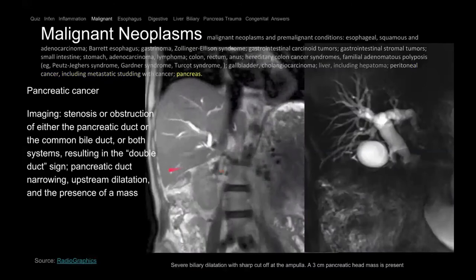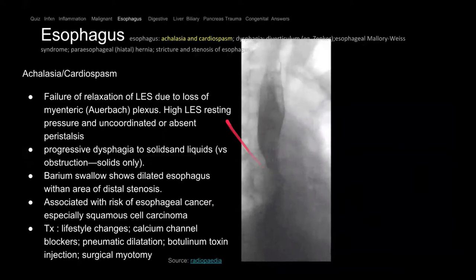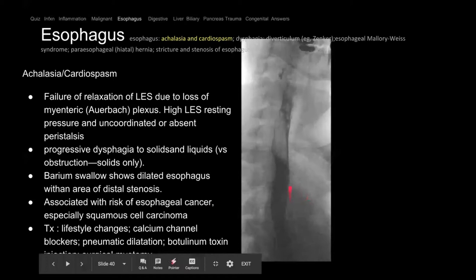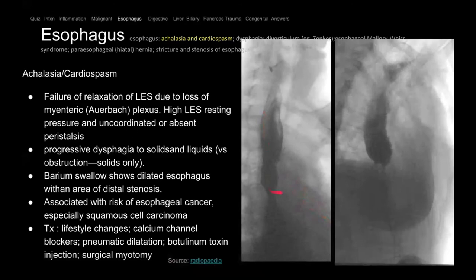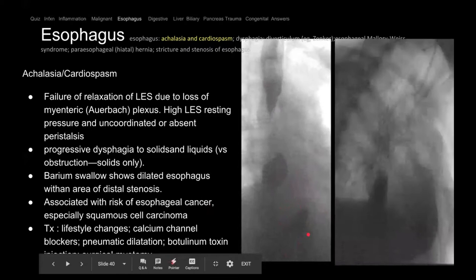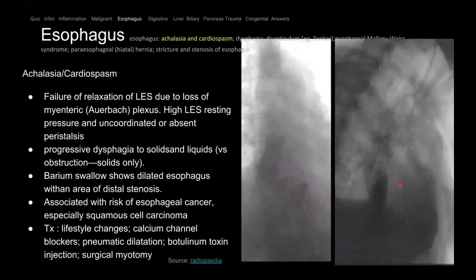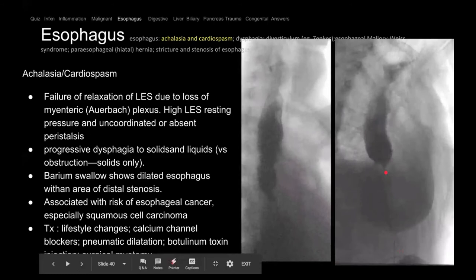Now we're moving on to the esophagus — achalasia. Here's an esophagram with abnormal contractions. The GE junction doesn't open — fluid stops at the GE junction. There's a beak-like appearance with just a trickle of contrast going down. Another patient with the same condition drinks barium and there's a little trickle at the GE junction that just stops. This is achalasia — the myenteric plexus are not working well, so the lower esophageal sphincter does not relax.